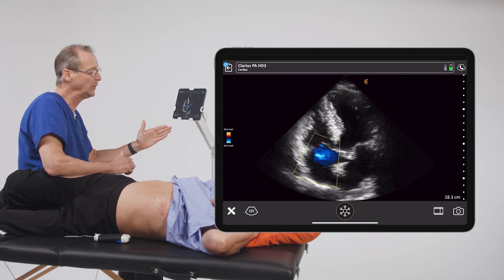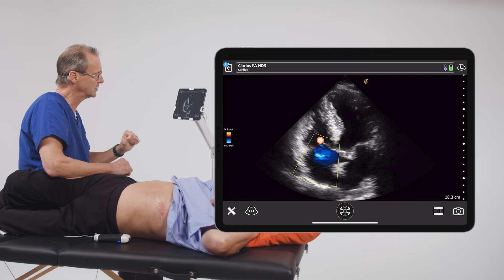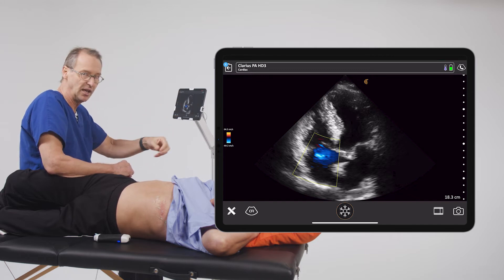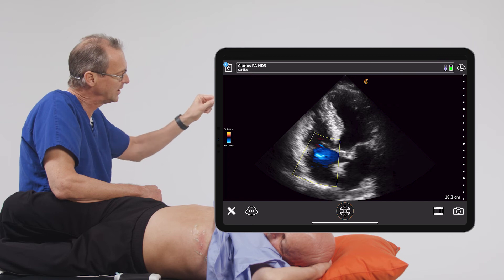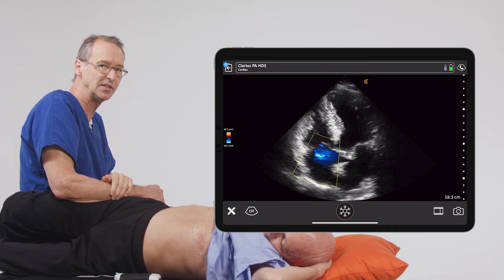Of course, physiologically, we know that blood moves normally from the atrium to the ventricles. And since that blood flow would be going towards the apex, it would be assigned a red color. But we see blue in the right atrium, and this is an indication that blood is moving from the right ventricle into the right atrium — and of course, this is due to tricuspid regurgitation.